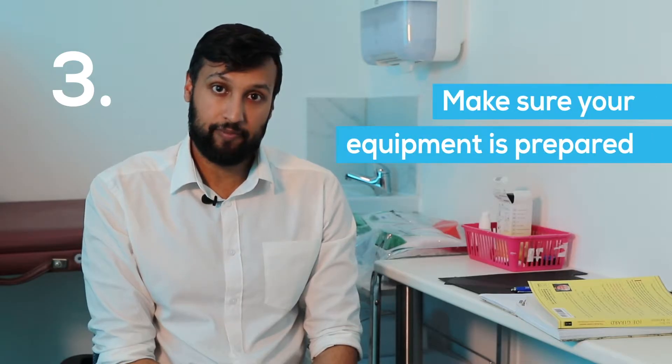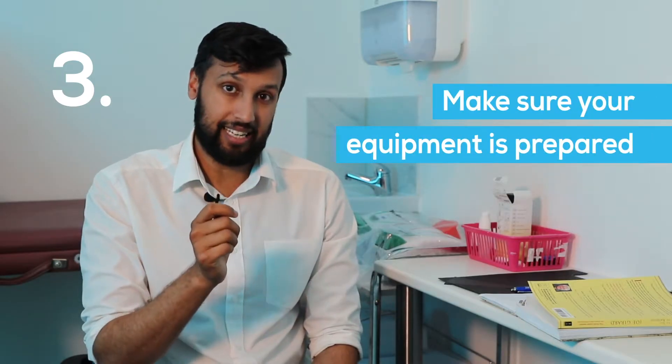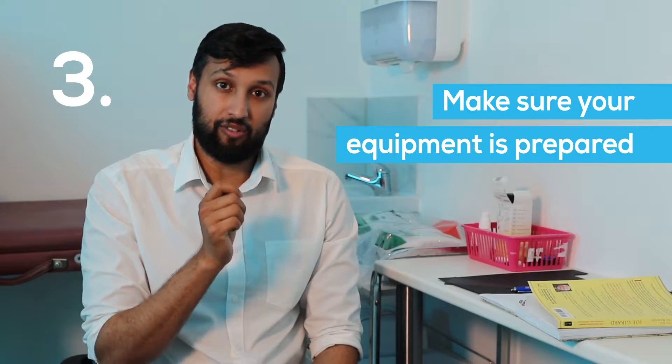Three, make sure your equipment is prepared and make sure the vaccine is in date. Ensure you select the right needle size and gauge of the needle.